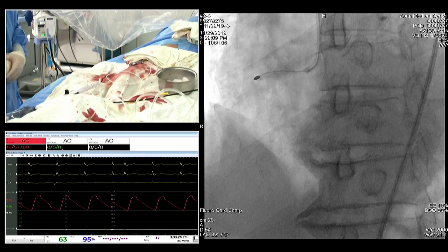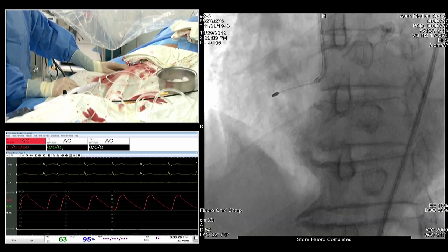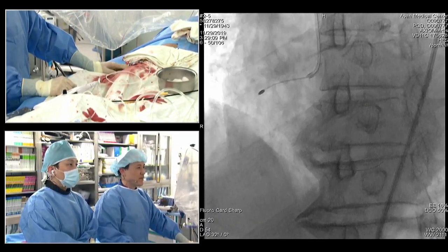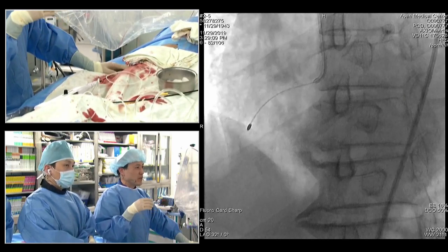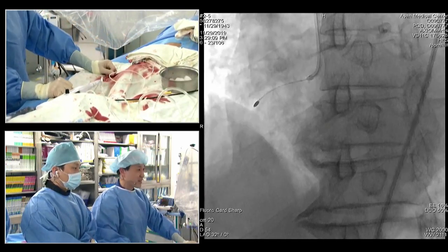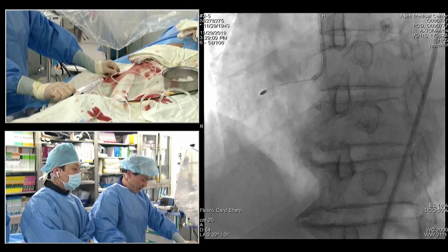Already there. So, Dr. Colombo, I work with John Tobis, one of your colleagues. Before, I used to use vasodilators in the rotoflush, but everybody would get hypotensive. So we follow your paradigm. We give 10,000 units of heparin in one saline bag. So that's our heparin flush. It's cheaper, too. We don't put any nitroglycerin, verapamil, or stuff like that. Yes, they get very hypotensive.